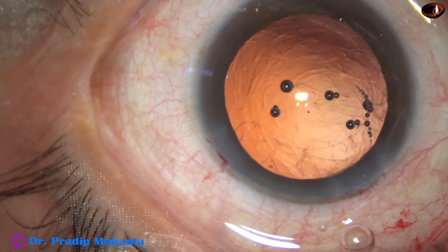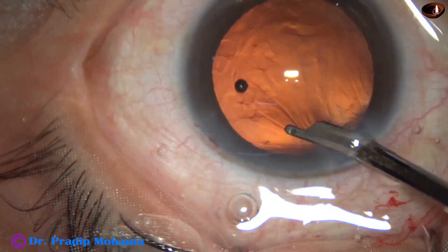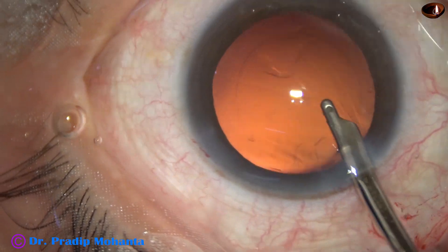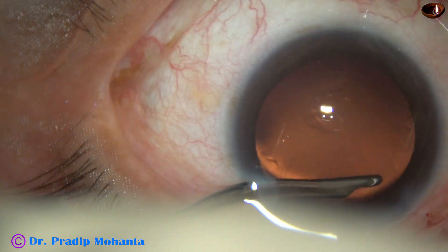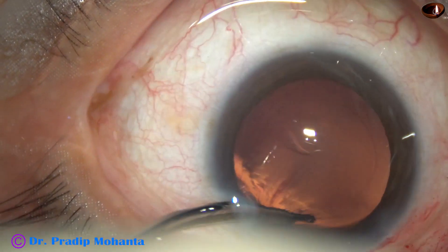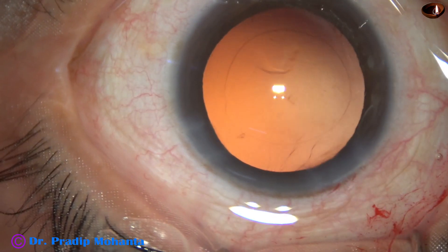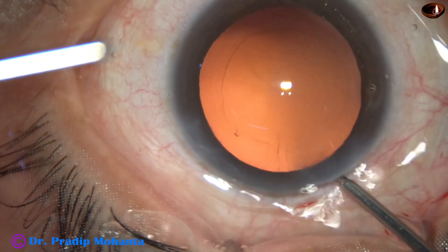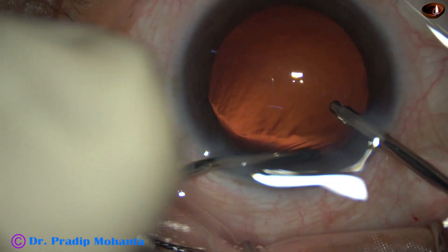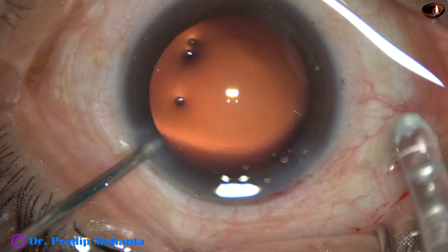Inject visco, take the 23-gauge Simcoe cannula and aspirate the fibers. You can aspirate the fibers from all around except the sub-incisional lens fibers. A few lens fibers are still there. Now I took the irrigation-aspiration probe and removed these sub-incisional fibers.